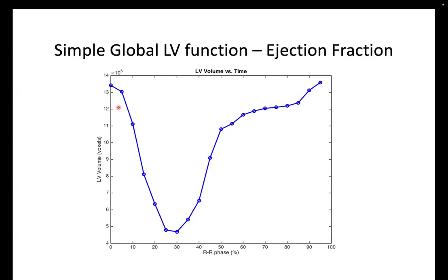And when you calculate the volume inside the left ventricle, and nowadays with deep learning, it's super trivial because the deep learning segments out the blood in the left ventricle, decides where the mitral valve plane is, decides where the aortic outflow tract begins, and it consistently puts those limits on the volume. And then you measure the volume inside that.